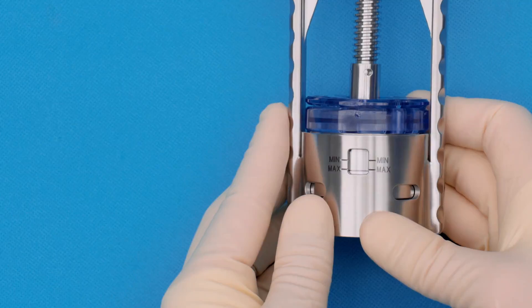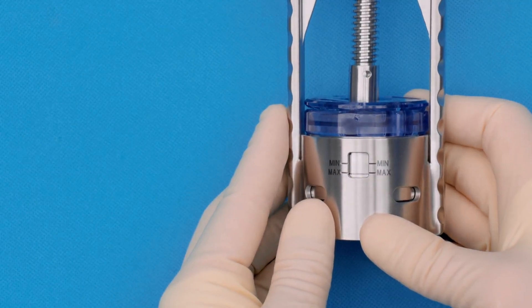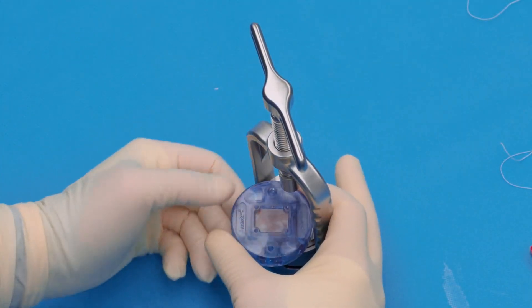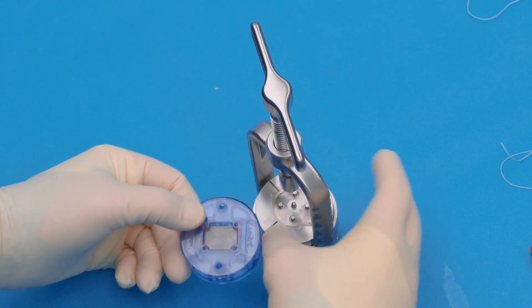We're then going to leave that at the max point for four minutes and the graft will stay compressed. Once we've given it that four minutes, we're going to loosen it up and the patch is ready to go.